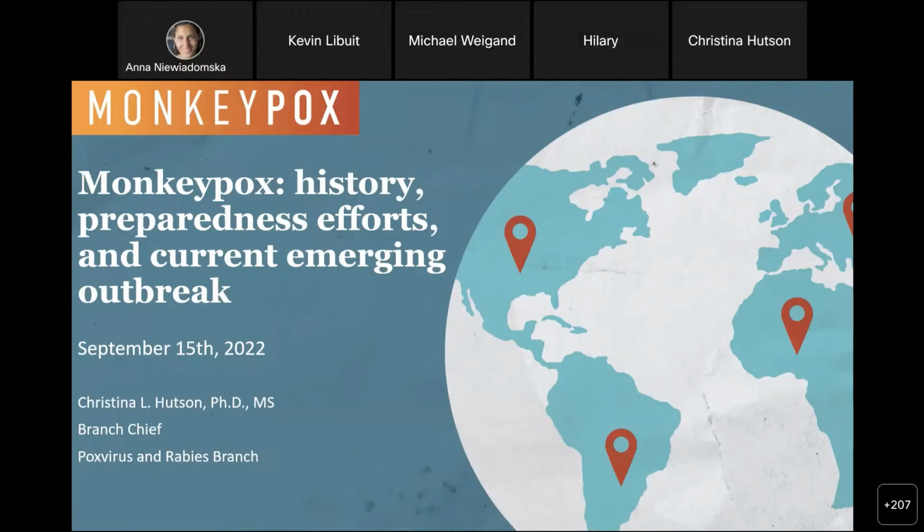The main reason I wanted to highlight this is because we actually work with the LRN labs on an almost annual basis, scenarios where we send them clinical cases or mock cases describing a patient, such as someone who had travel history, has a history of fever, etc. That mock scenario goes along with specimens that are spiked with specific viral DNA. So it's a way for us to work with the state EPIs and the state levels so that they're very familiar with this algorithm and also how to run and interpret those results.